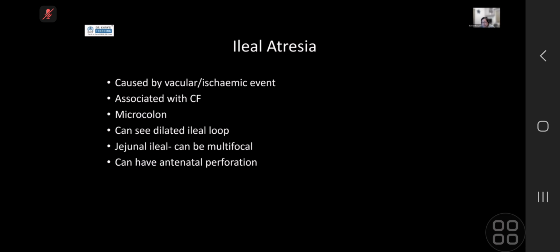So what I started off with, I think it was a bit tricky, as in nobody really knew whether it was truly atresia or not. So what I started off with was an ultrasound first, because I think ultrasound gives you an overall view of what to expect. What I saw was very dilated bowel loops, lots of it. But I could also use ultrasound to look at your SMV relation, which helped me to preliminarily, and I say preliminarily, exclude malrotation.